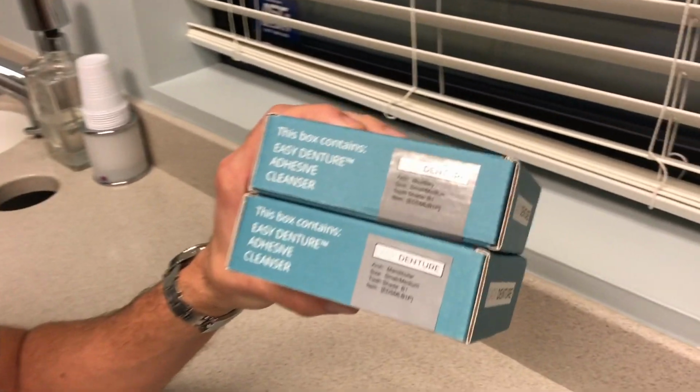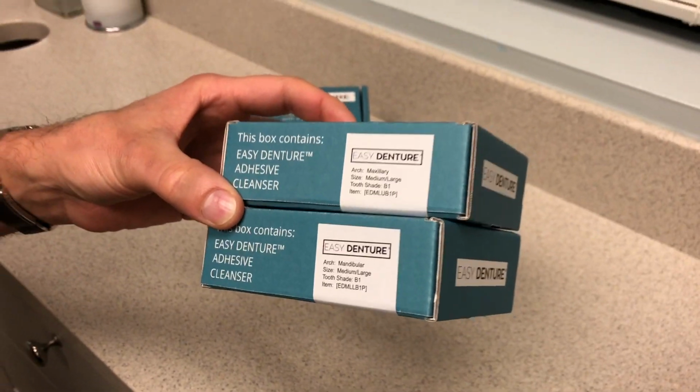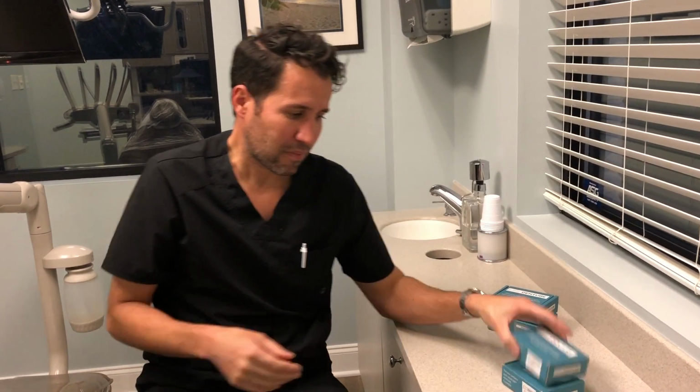So you have a maxillary small medium, mandibular small medium, and also a medium large. So your larger sizes, typically the medium large is going to be for a male or your taller females. A small medium is going to be for your females and maybe smaller males. But inside is basically the same thing for each one.